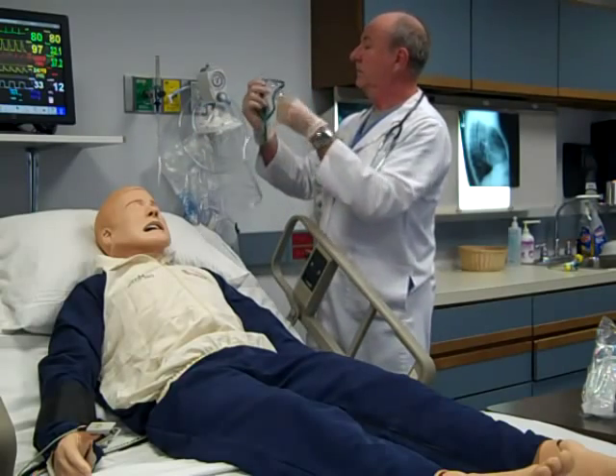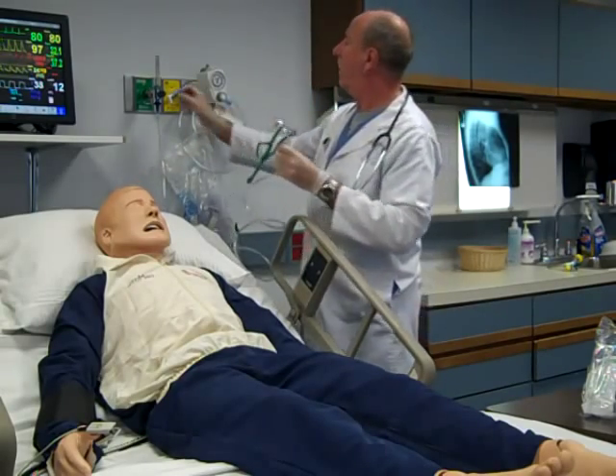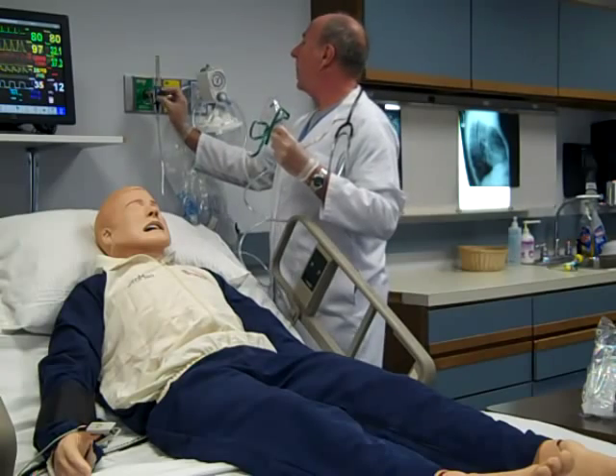Set the flow meter to the prescribed flow. Always read the center of the floating ball for correct flow.